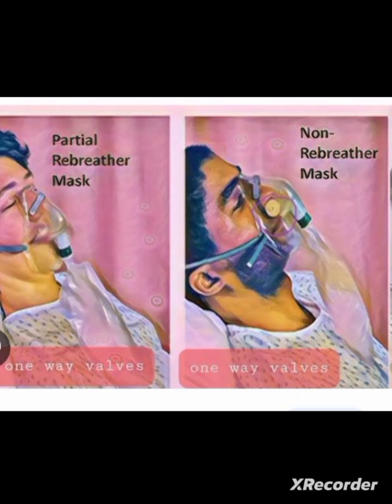This device is not used for COPD patients, and not used along with a nebulizer. High humidification is also not needed in the partial rebreathing mask.